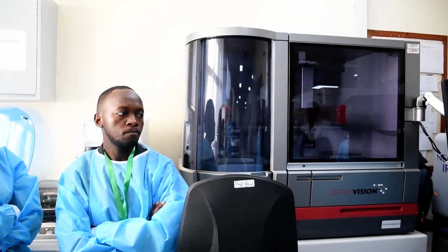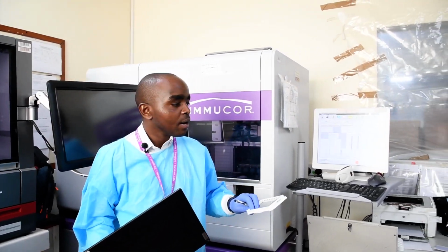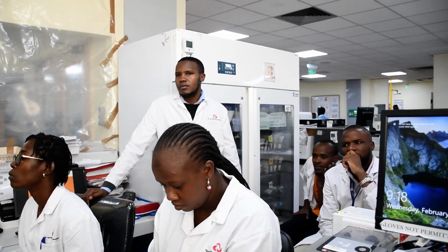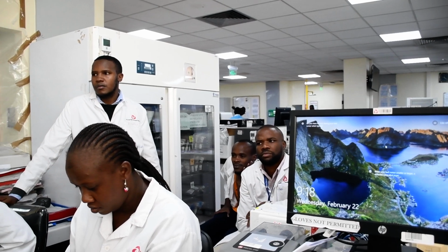Yes, we are going to see how the specificity of this equipment has been set: for the IgM, we are going to use the normal plate that we use for blood grouping. For the IgG anti-A or B, we are going to use the Capture-R Select.